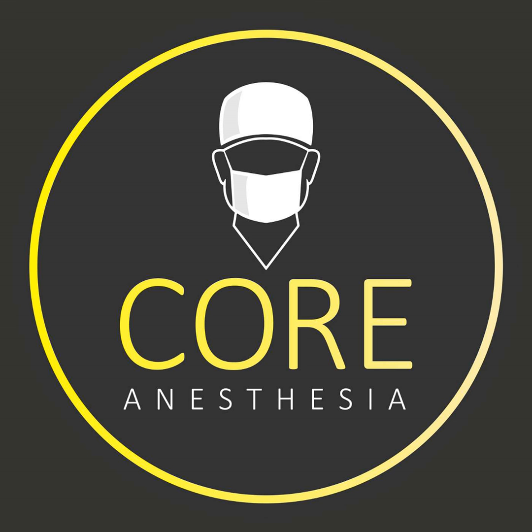Like Cole mentioned with the nasal ET tubes, you're not going to want to use nasal airways if you have a skull or facial fracture. You don't want to use them in pregnancy. They have the risk there of bleeding with the very friable tissues. Or if they, again, have any kind of coagulopathy, then you don't want to use that nasal airway. I think the nasal airway is actually really nice, not in those situations, obviously, but oftentimes they will tolerate that a little better than the oral airway, and it won't cause the stimulation for them to kind of cough and gag on the oral airway. So the nasal airway often, I think, is really nice if maybe you have trouble getting the oral airway in, or you simply just want to go straight to a nasal airway.